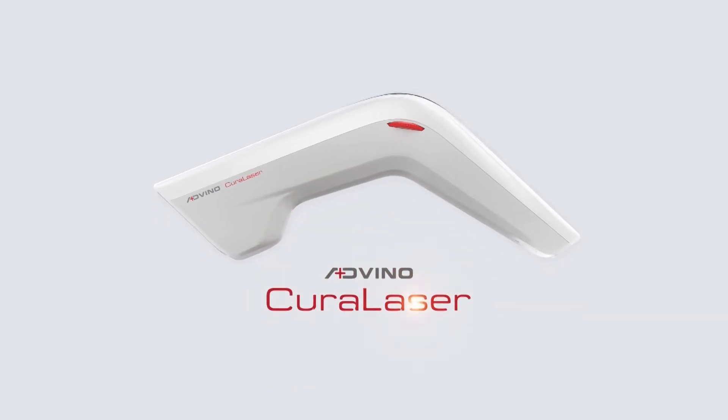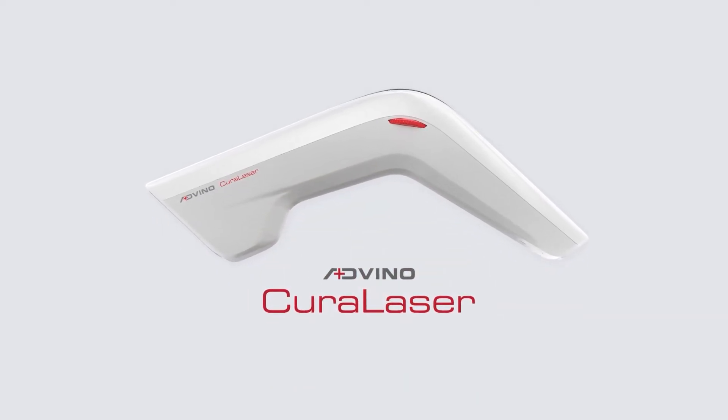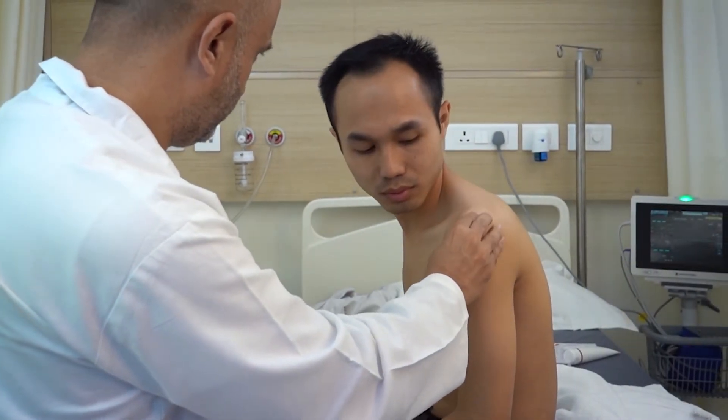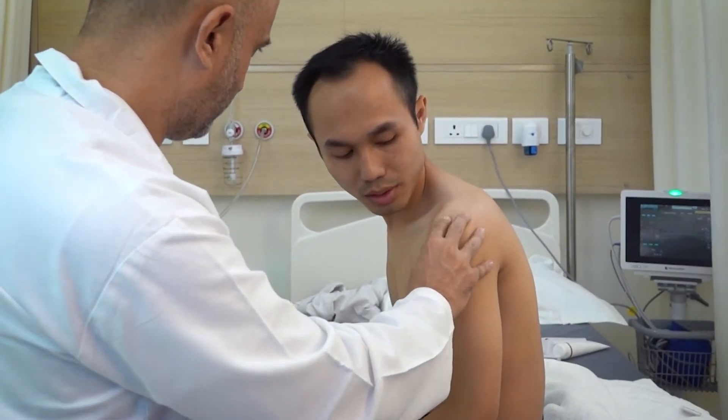This video demonstrates the use of ADVINO CuraLaser in shoulder pain. Assess the shoulder for swelling, inflammation, and muscle spasm before starting the treatment.